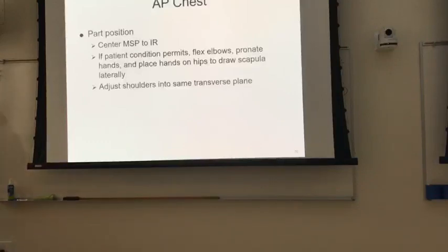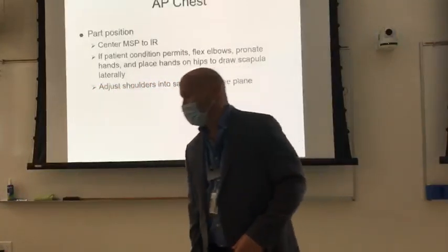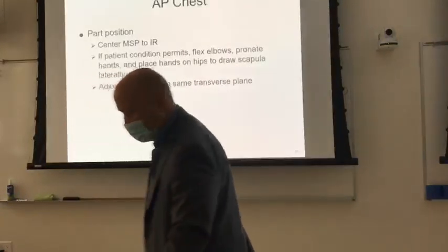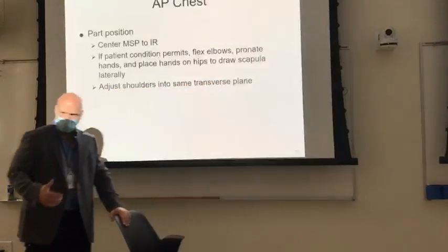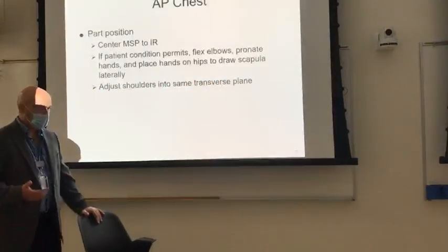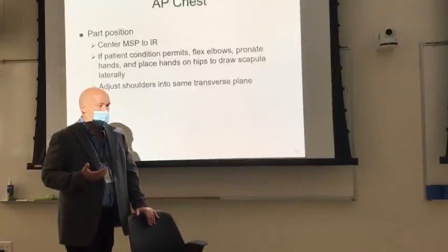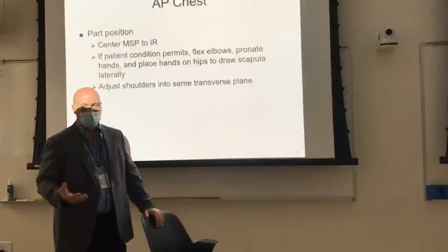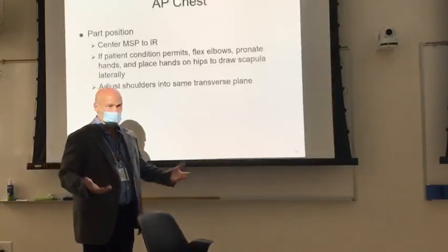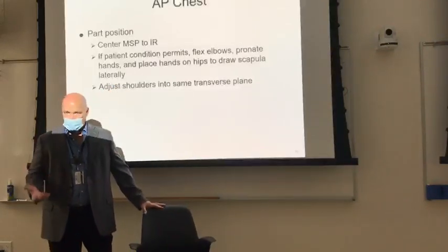Okay, so AP chest, you will shoot almost as much as you will shoot PA chest. And that happens whenever we have a patient who can't stand up, and we either bring them to the department because they can't stand up, or it may be that they're so sick they can't come to the department, we have to go up to their room to shoot portable. So a lot of portable chest x-rays.